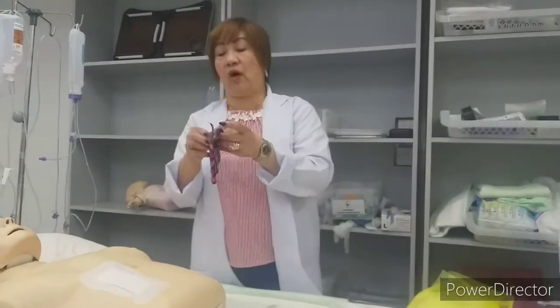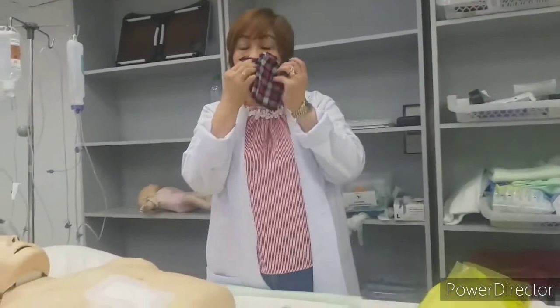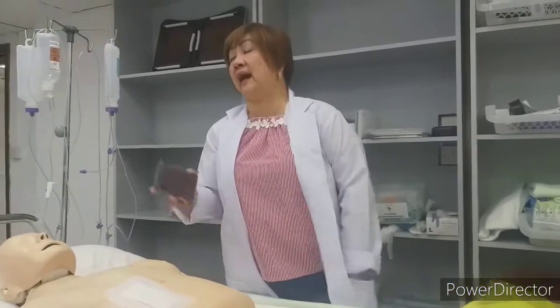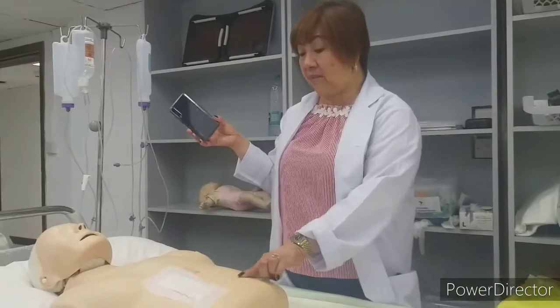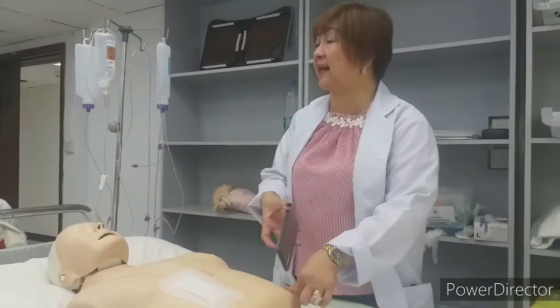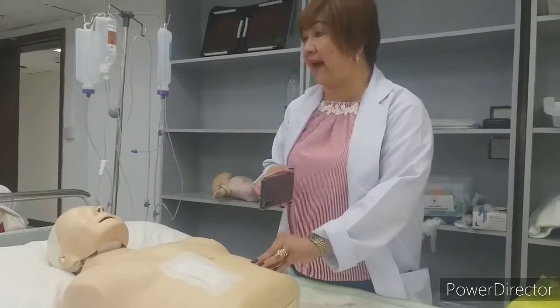Percutaneous endoscopic gastrostomy means to say that the feeding tube is inserted through the skin on the abdomen directly to the stomach. So that is the peg.